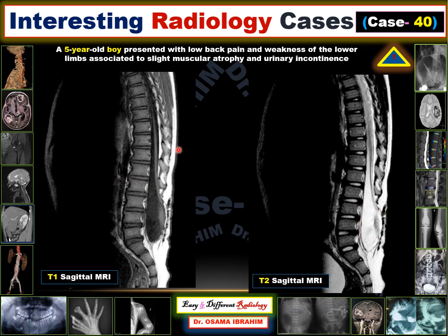What is the abnormality in this five-year-old boy presenting with urinary incontinence? If you look at the spinal cord, it has an abnormal position and there is thickening of the filum terminale. There is also widening of the spinal canal and a suspected defect in the posterior element of the bony component of the lower lumbar vertebra.